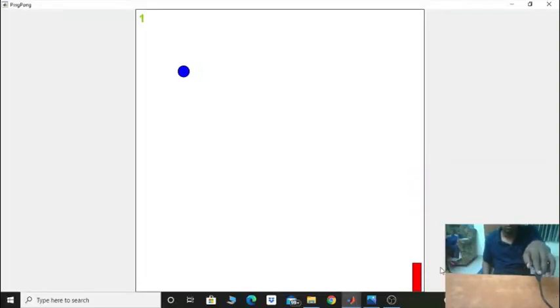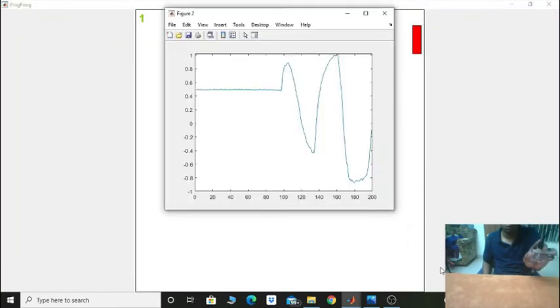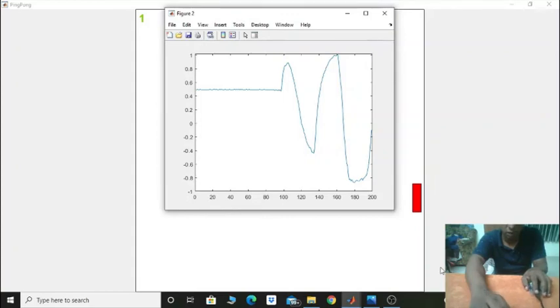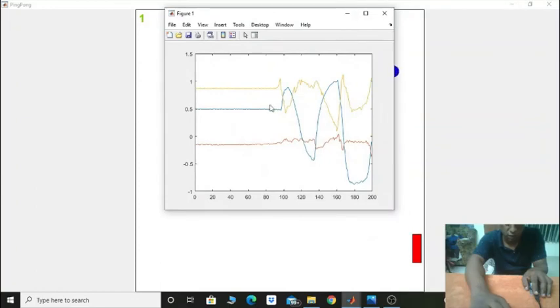The system has also been integrated with the Pingpong game. You can see as we move the arm up and down, the Pingpong table will also move. And after a preset duration, here we have set it to 20 seconds, the reading from the accelerometer will stop controlling the Pingpong table, and you will be able to see the resulting waveform, which should be able to say how well you have been responding. The three axes you can see are now visible to you. Based on this, you can further track how the patient is performing.